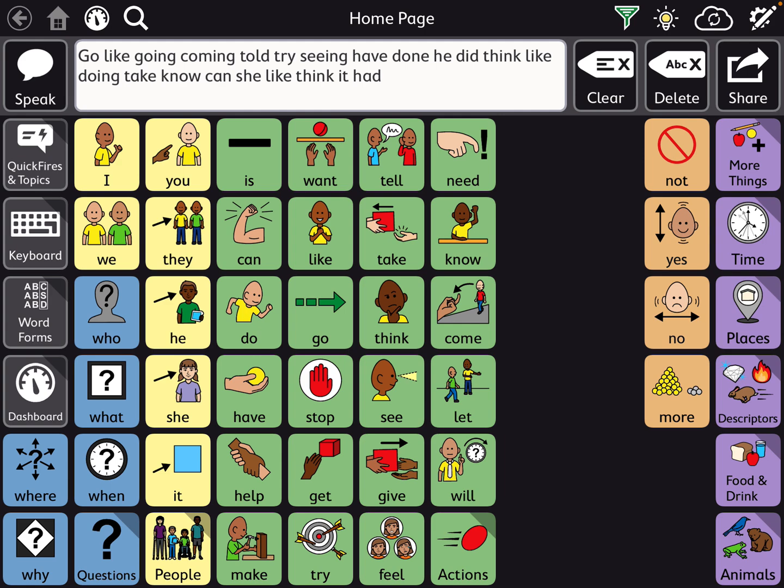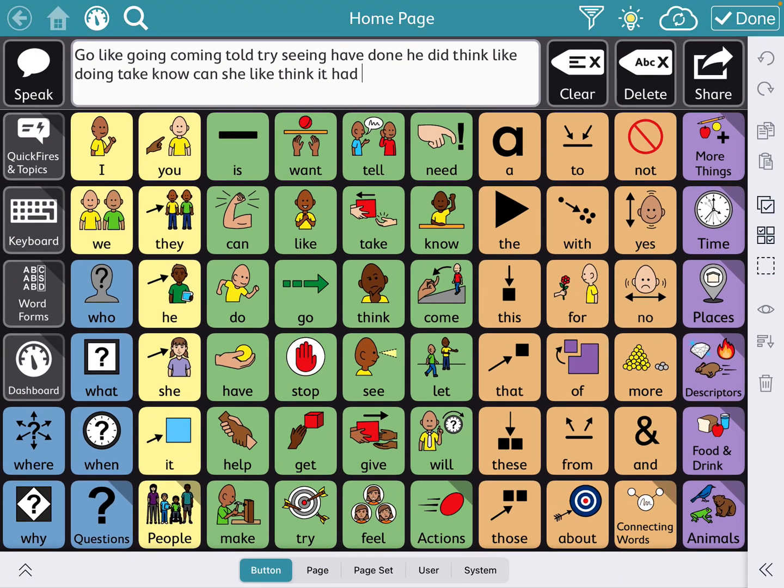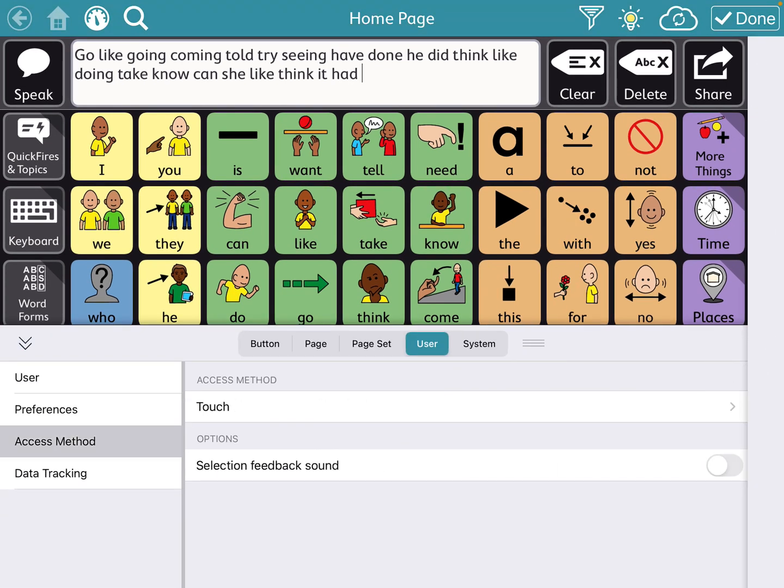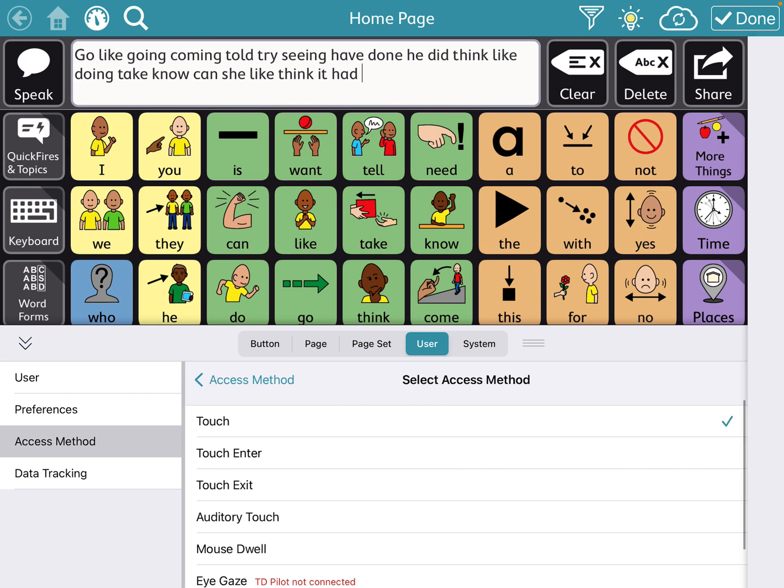So for kids that do do that dragging, make sure to go to the access method, touch exit, and turn on hold time.